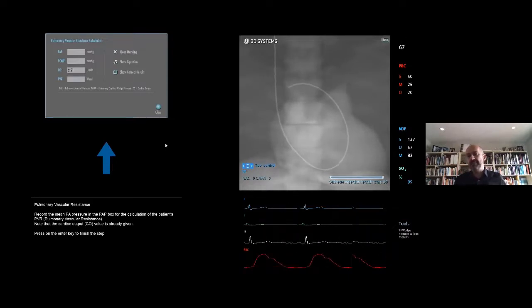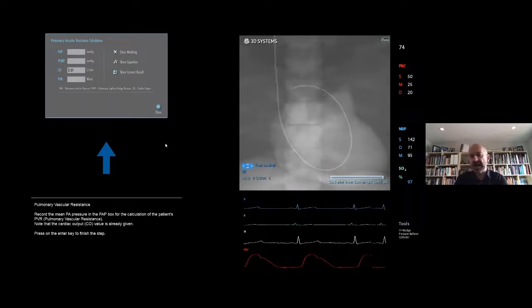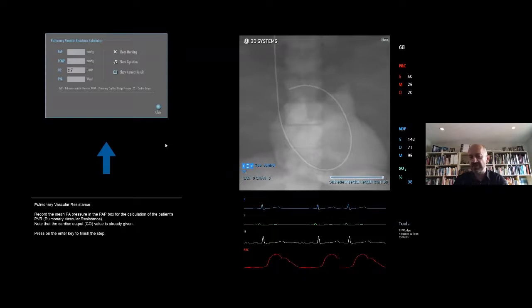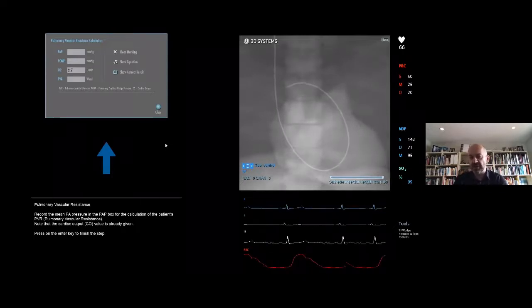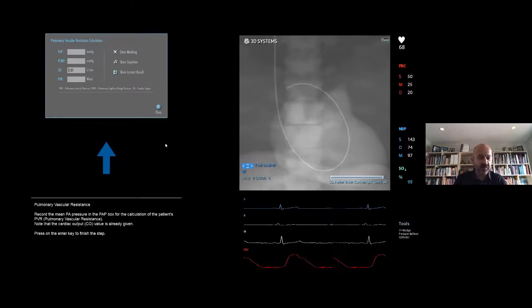This is best to practice at the bedside on your Swan before you insert it because different manufacturers make different Swans. So make sure you know where you're going to inject before you do it in the patient. And that's it. You've really placed the Swan in at the bedside.